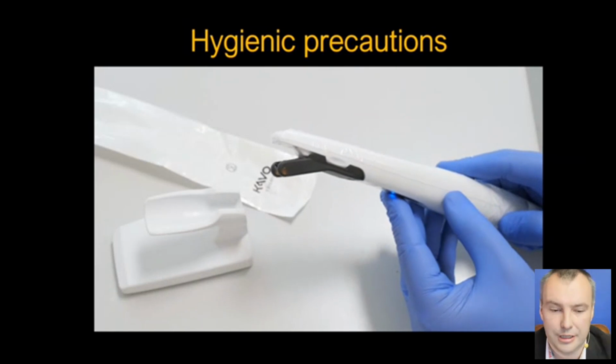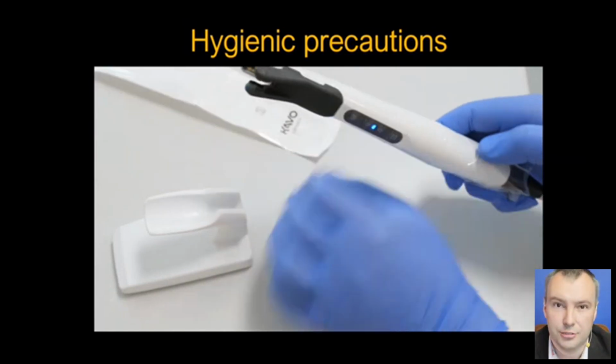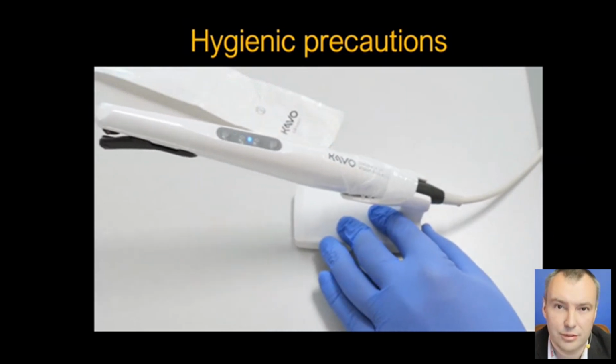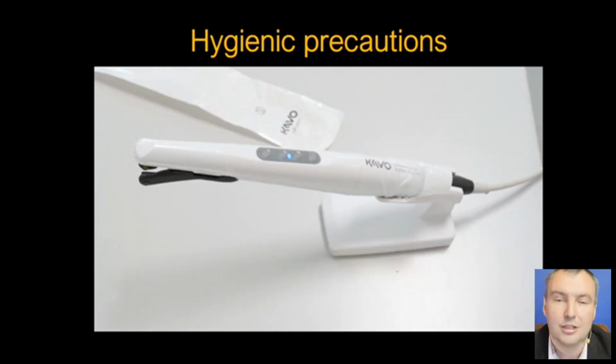The transillumination tip you can put into the autoclave. It is autoclavable, so it can be autoclaved between patients. The DiagnoCam, of course, is not, hence the plastic sheath. For both the transillumination tip and the DiagnoCam, you can also use some mild disinfectant to locally disinfect them as well.